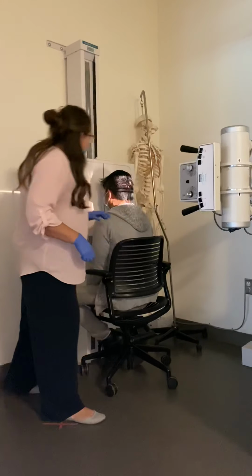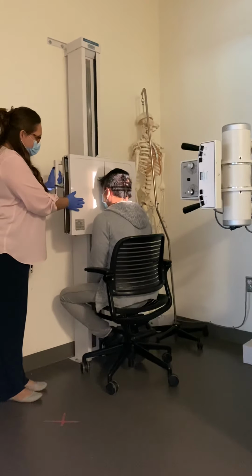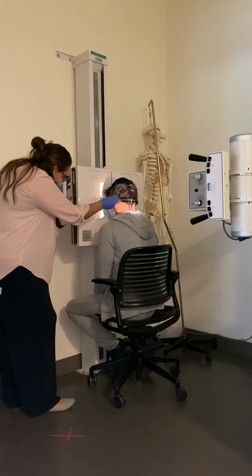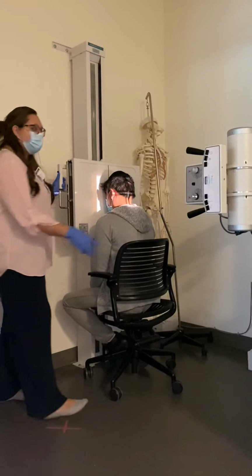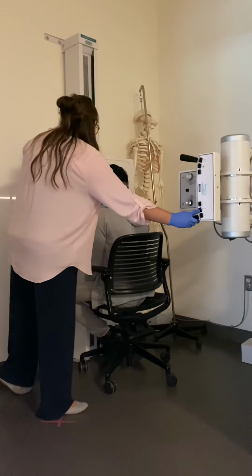All right. So for this one, I want to have my patient put their forehead and nose on the board. So tip your chin down just a little bit. And then I want to make sure that my OML is perpendicular to the IR. So tip your chin down just a little bit more. Good. Now for the mandible, I'm going to have my central ray exiting at the level of the lips.